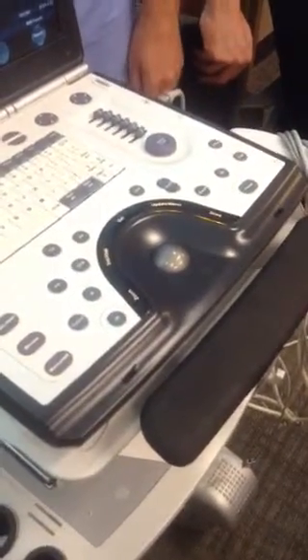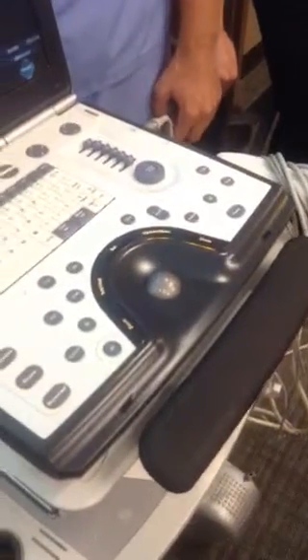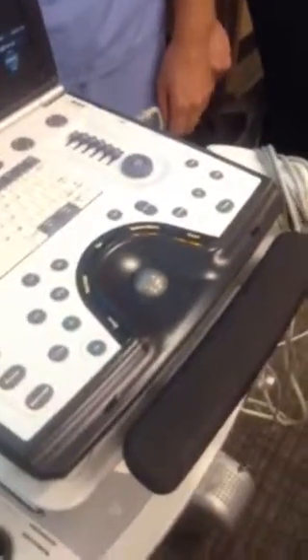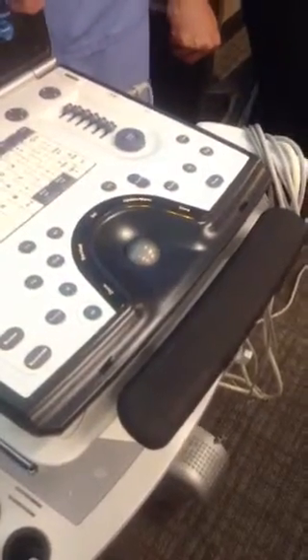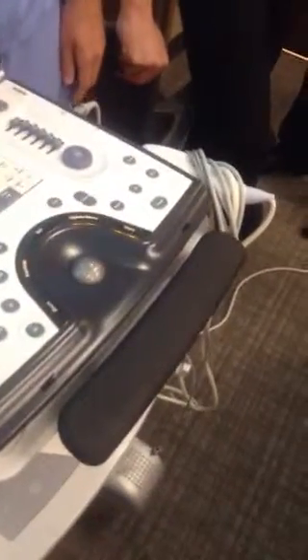When we scan, we'll do one complete echo. But this time we have to press freeze before pressing store. You could hit store, but what it's going to do is show the whole M mode go by in a live loop, which nobody really wants to see. You want to see the whole image. So it wouldn't be the worst thing in the world.